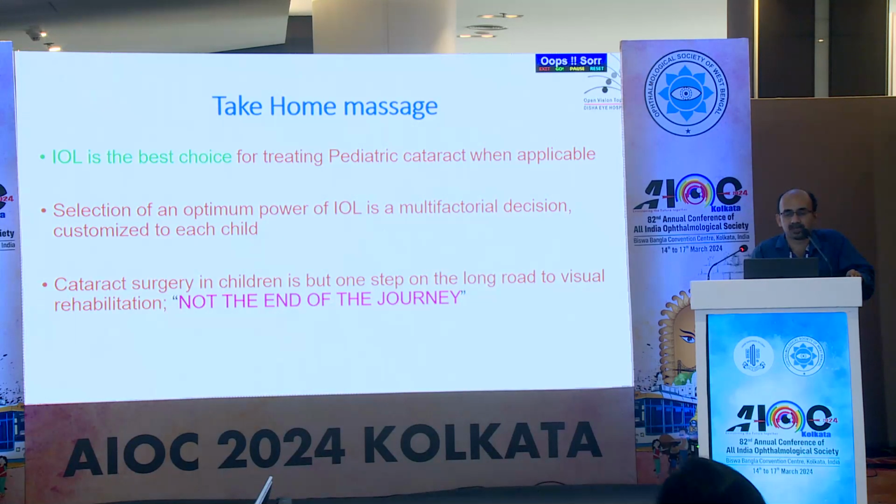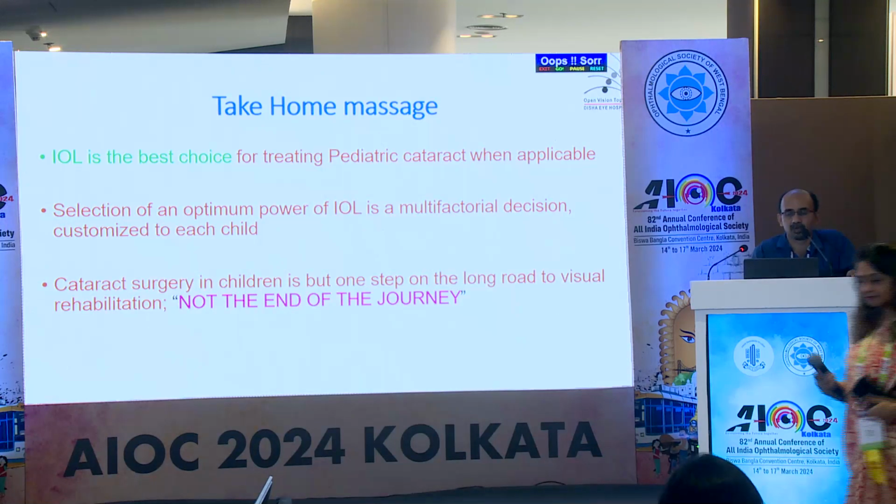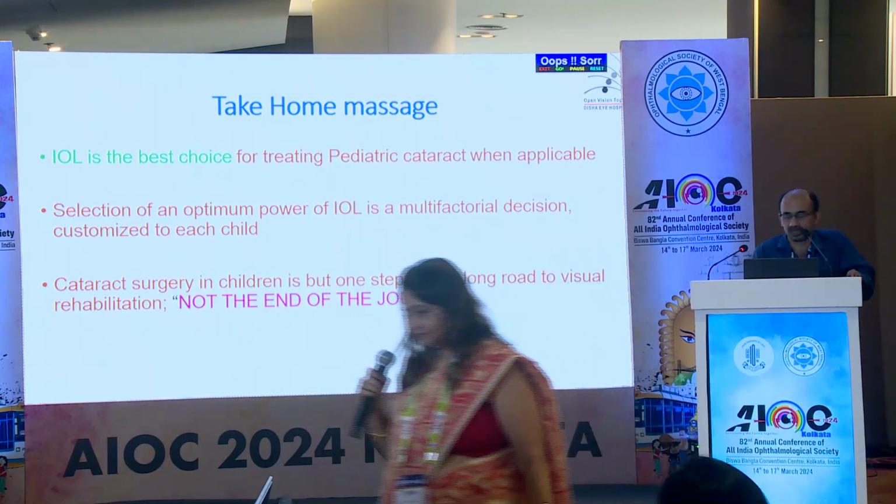Selection of optimum power is a multifactorial decision, and cataract surgery is but one step on a long road to visual rehabilitation, not the end of the journey.